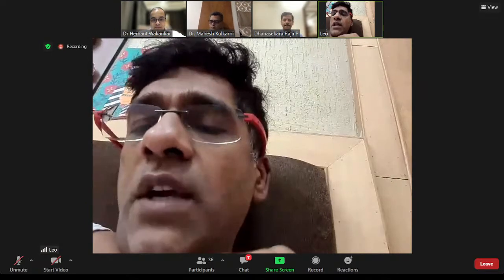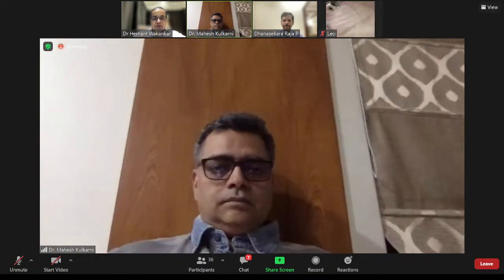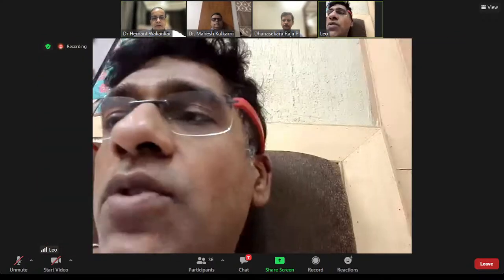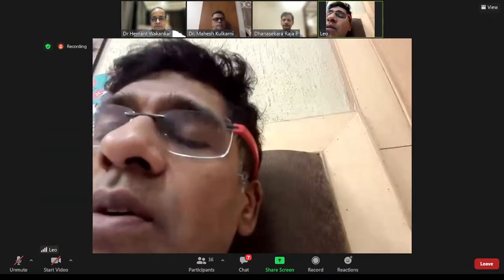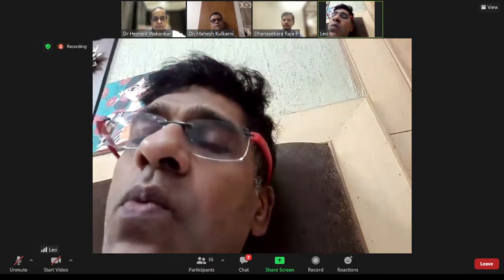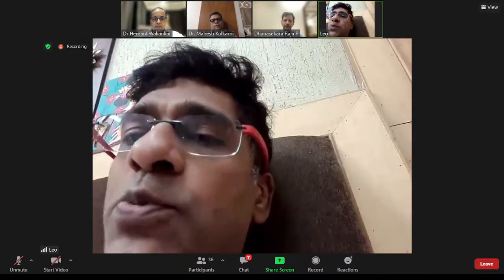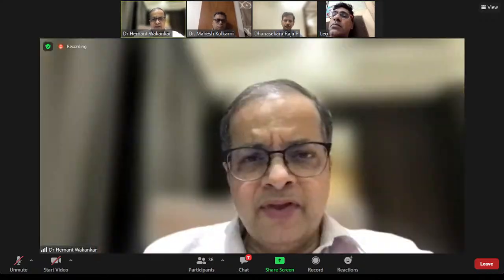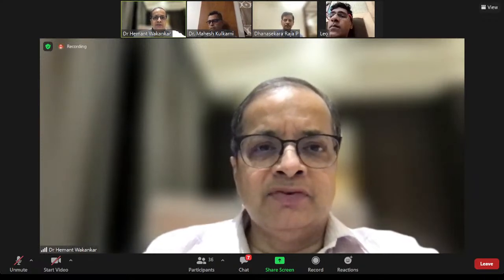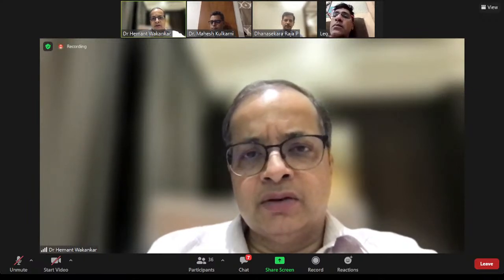So would it be fair to say... Sorry, lost your audio, Leo. Sorry, do you hear me now, sir? Yeah, better now. So taking on from your answer regarding choice between cones and sleeves, would it be a fair argument to say that if you have reasonably good bone stock, stick to sleeves, but if your bone stock is poor, you may have to consider cones? Yeah, that's a fair argument, because a sleeve also gives excellent fixation, but you need decent metaphyseal bone for that. Ultimately, it boils down to that. So yeah, that's a fair comment.